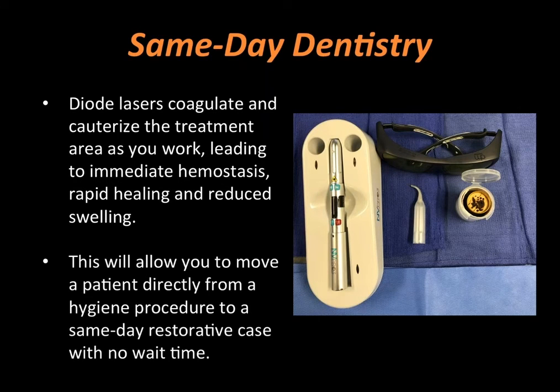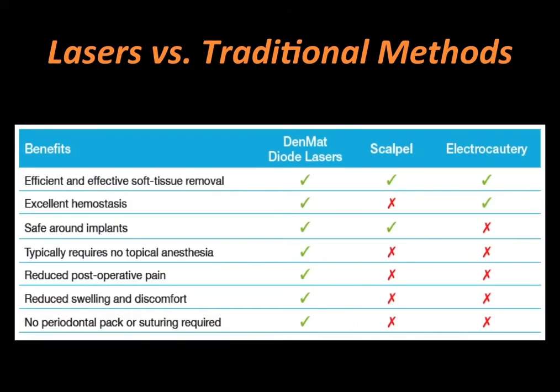This allows us to move a patient directly from a hygiene procedure to a same-day restorative case with no wait time. You know, oftentimes our hygienists will create kind of a messy field for us, especially after scaling and root planing. And with the laser, we can trough for margins very, very effectively and stop bleeding of the gums and reduce any swelling that may have occurred.